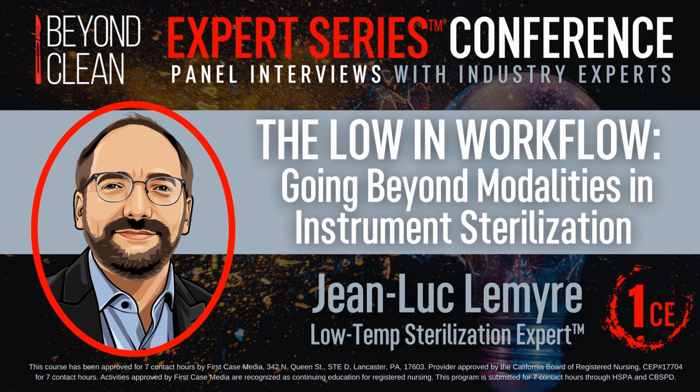And through the investigation to understand the cause for it, our clinical team in the field identified an issue, or they thought that the tray they were using was problematic, so they shipped the tray back to our lab for some analysis. And what we found out is that the aluminum tray was destroying peroxide. But the tray model we knew was compatible. We validated it, and we knew it was compatible with peroxide.